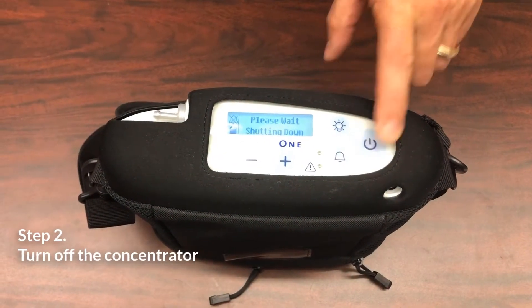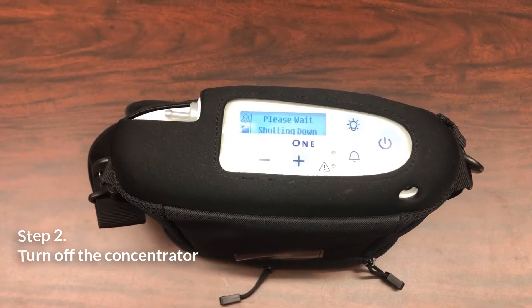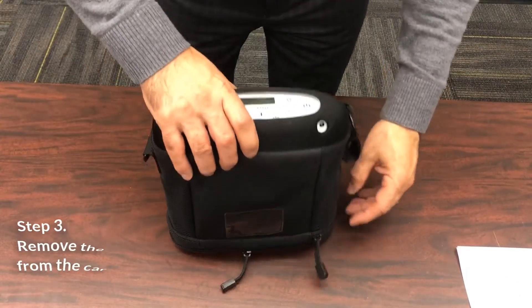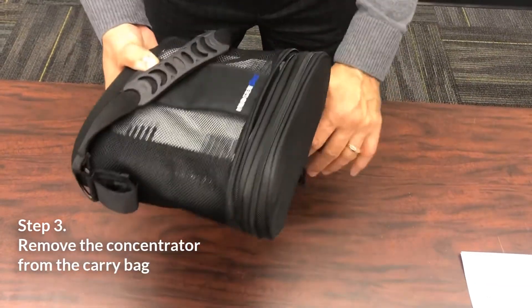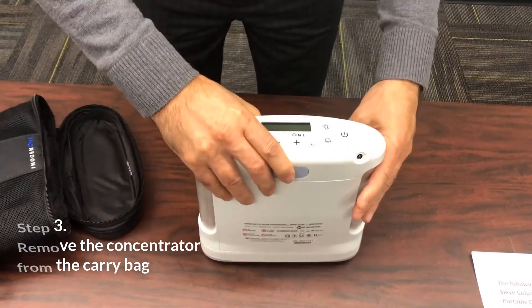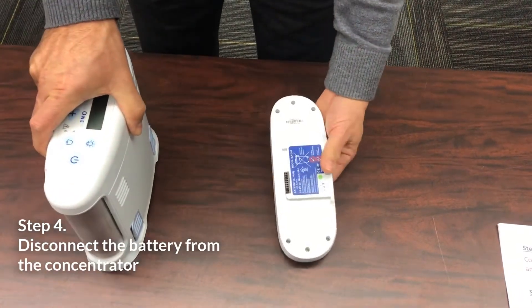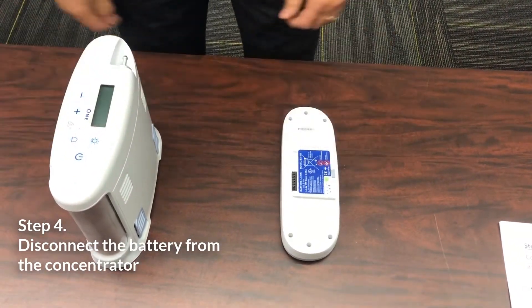Turn off the Inogen One Gen3 concentrator by pressing the power button to shut down the device. Remove the concentrator from the carry bag. Remove the battery from the concentrator by pressing down on the latch and sliding the battery away from the device.